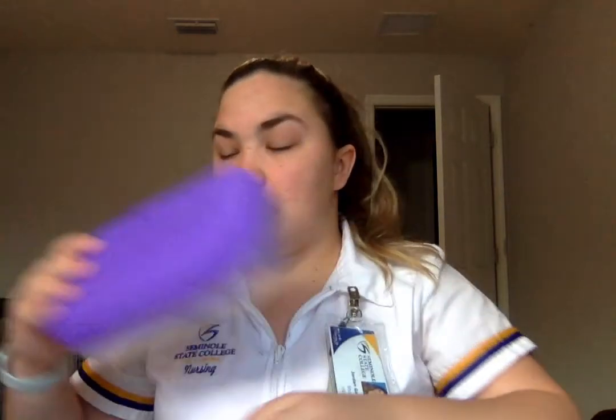So today I have all of my supplies that I'm going to be using. I'm going to gather those as well. So I have my medication, I have my needles, I have my syringes, I have my gauze, I have my gloves, I have my alcohol swabs, and I have my sharps container.